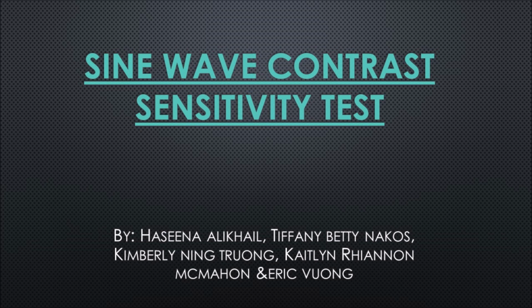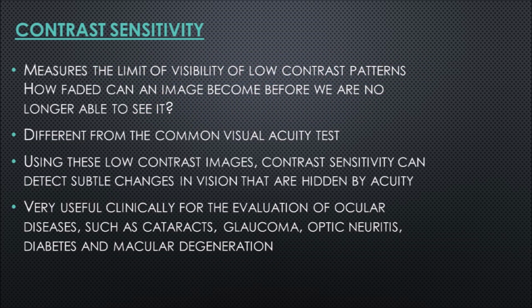We are going to demonstrate how to test contrast sensitivity using the sine wave contrast sensitivity test, as well as the interpretation of its results. Contrast sensitivity measures the limit of visibility of low contrast patterns. In other words, it measures an individual's ability to distinguish between finer and finer increments of light versus dark. How faded can an image become before we are no longer able to see it?